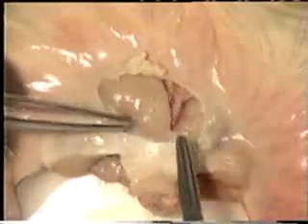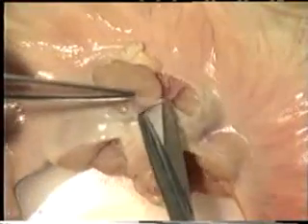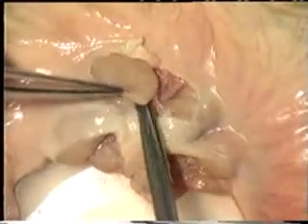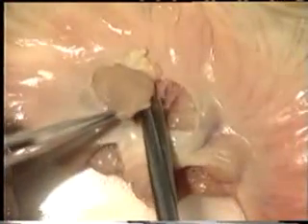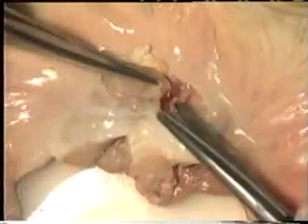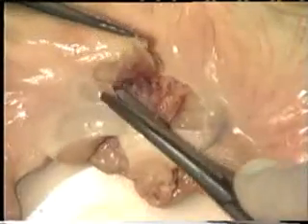If you do have to lift the lymph node, try and pick up the adventitia as seen here, rather than crush the entire node. As dissection proceeds, one should look very carefully for any feeding vessels. Often, these may need to be ligated or diathermied in real operative circumstances. Care must be taken not to damage the vessels in the base of the mesentery underneath the node, which is then dissected out in its entirety.